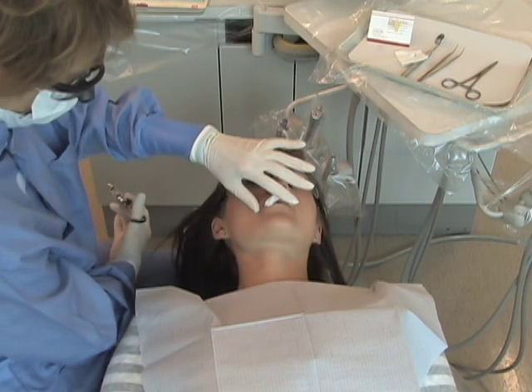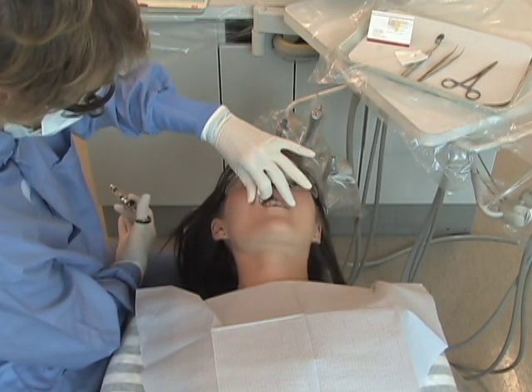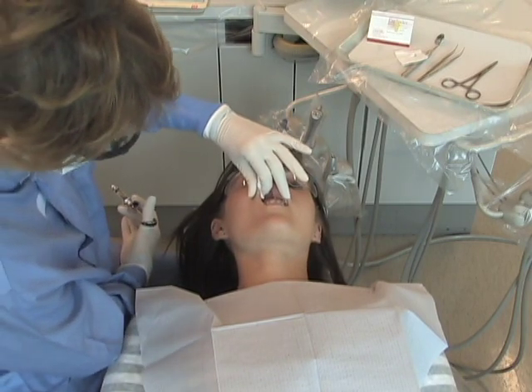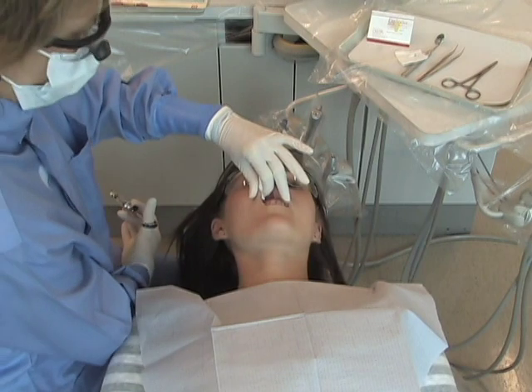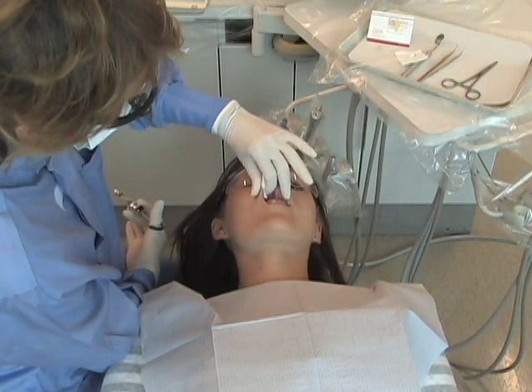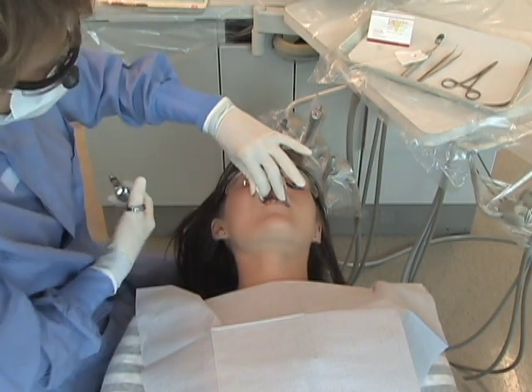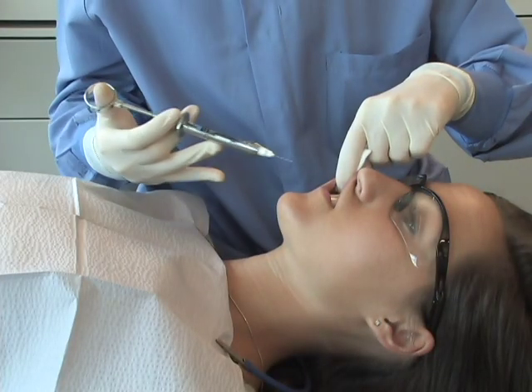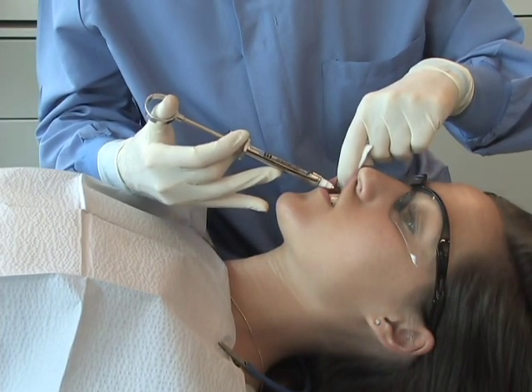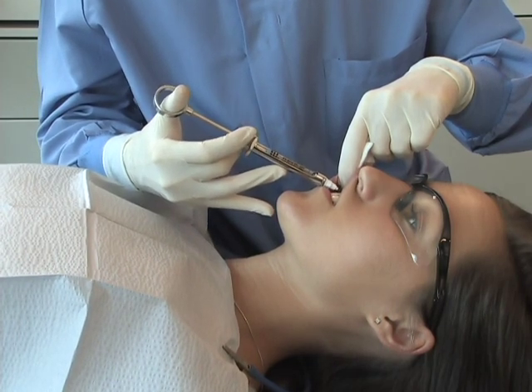Always attempt to keep the syringe out of the view of the patient. It is much easier to achieve this by placing the tray setup behind the patient's head. For clinicians with across-the-chest delivery systems, it might be necessary to use a mobile cart. Attempt to cover the patient's eyes with your non-dominant hand when bringing the syringe close to the patient's mouth. Under no circumstances should the syringe be brought directly across the patient's eyes.